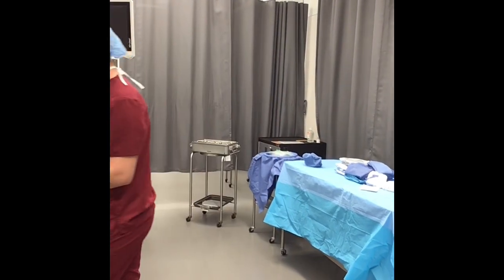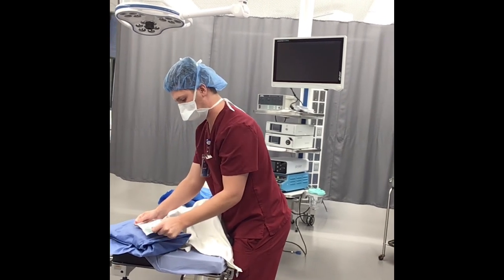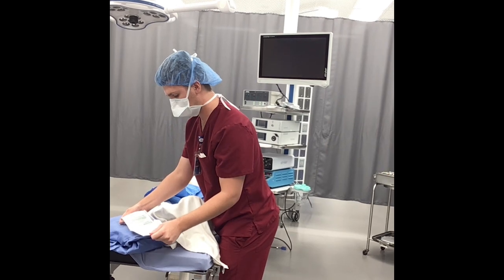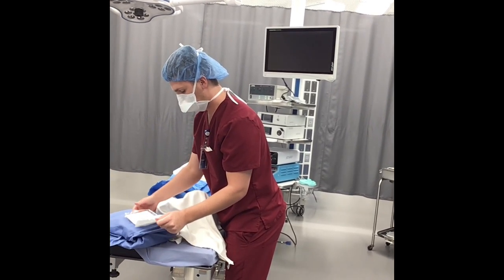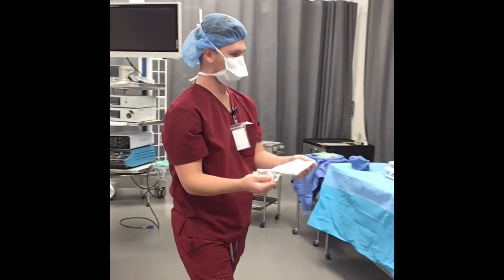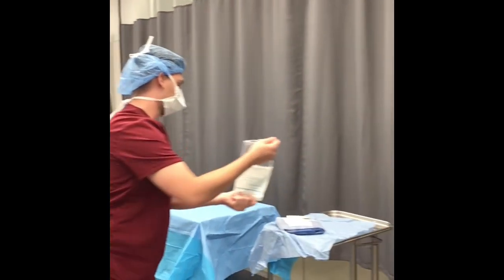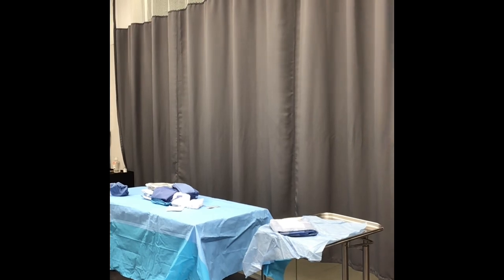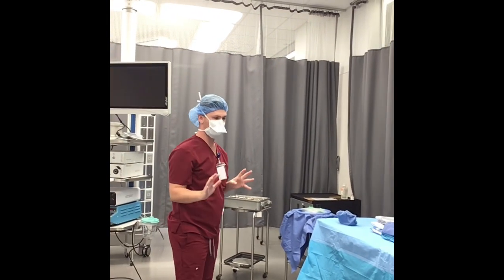I'm going to do the same thing over here. I'm opening up my gloves all the way. Otherwise, because of these pockets, they tend to stick inside these pockets. So I try and release them as best as I can without going over the heat seal edge. I'm going to do the same concept, 12 to 18 inches, for my gown. Rock forward. And it sticks. All right, so I have everything open.